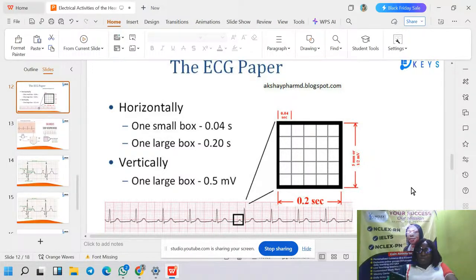Where are you? I hope you still remember the R wave is the tallest part of the ECG strip, okay? So how many R are here? 9, okay? Who else is saying 9? Is she the only one saying 9? Who else? Okay, at least I have 3 people that have seen 9.